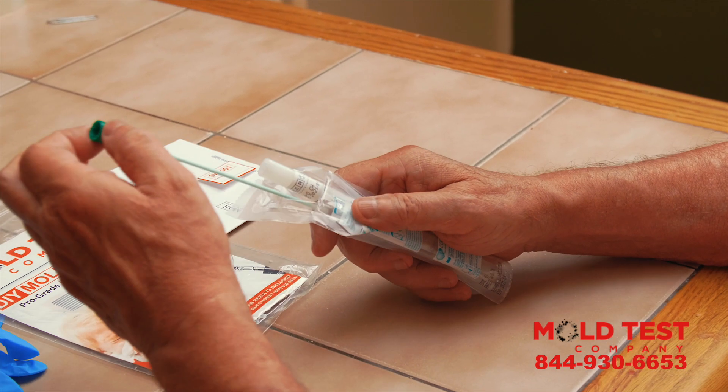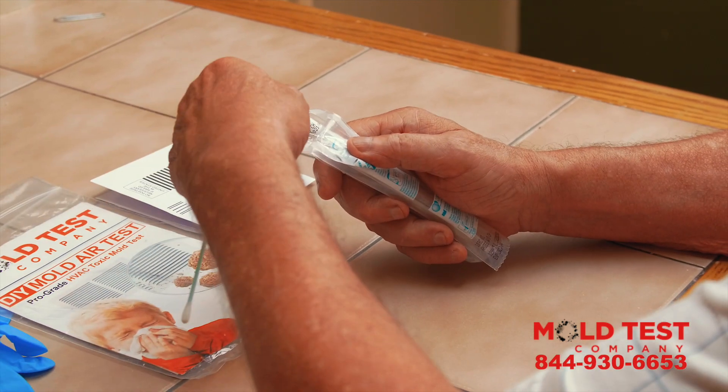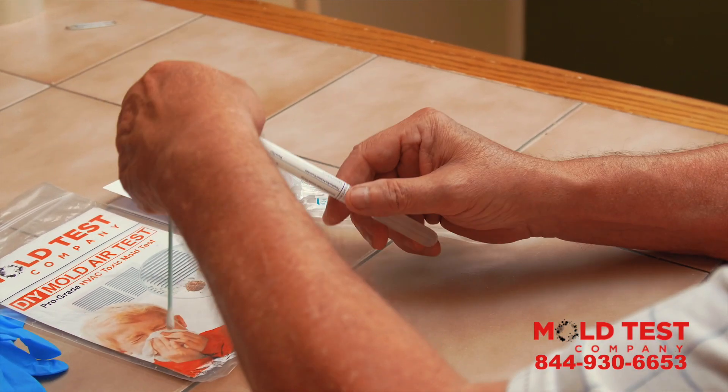Step 1. Remove the HVAC swab and the swab transport container from the plastic wrapper.